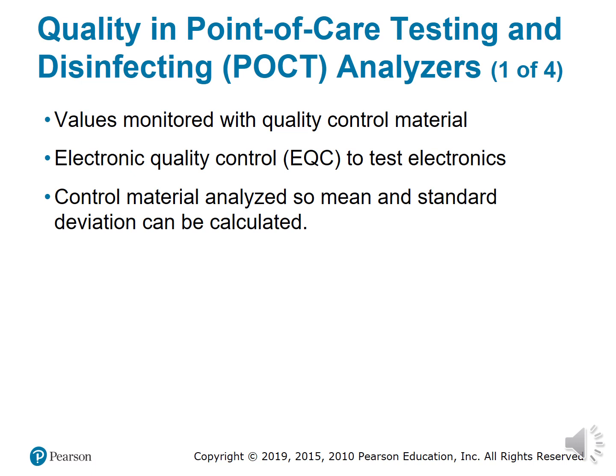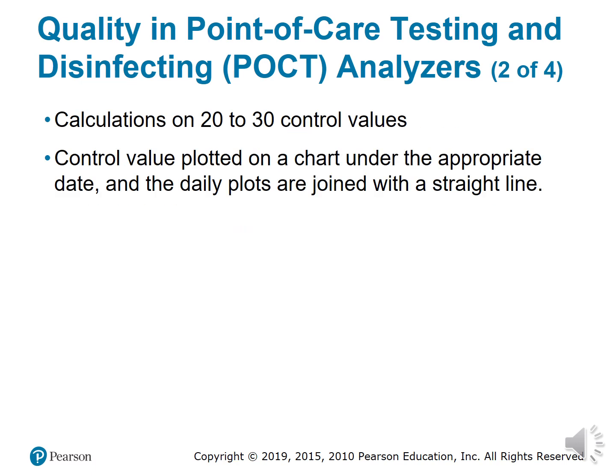Quality material is analyzed, so means and standard deviations can be calculated. This is to make sure that when you are testing, the results you are obtaining are reliable and accurate, and it also keeps the instrumentation up to par.